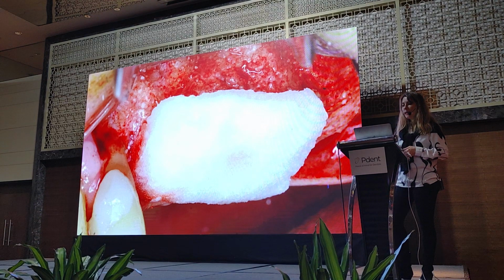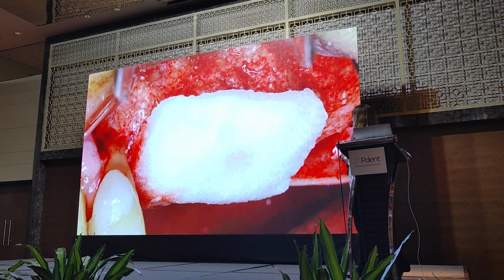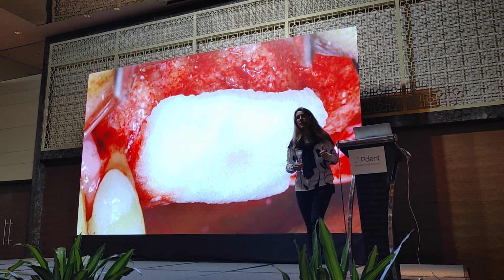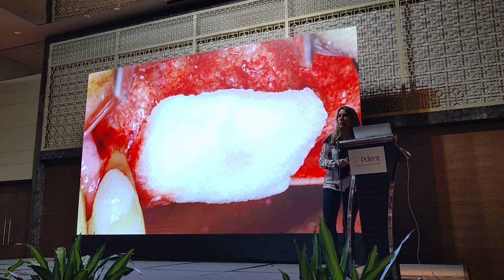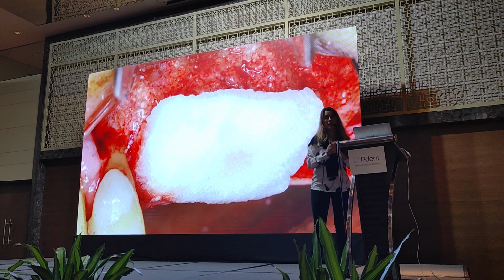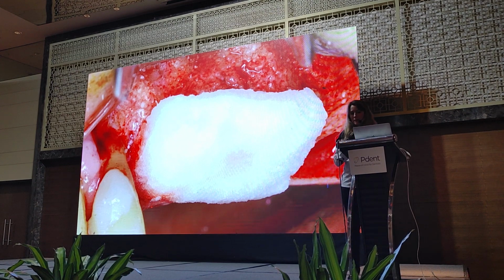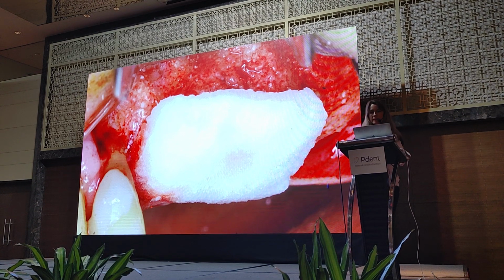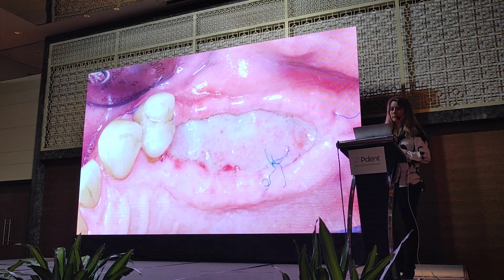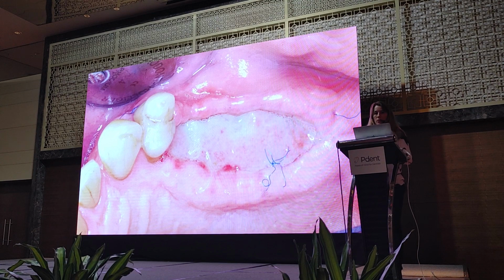I had a very bad idea of using a xenogeneic matrix. These matrices you can use on perfect patients, but never on a patient who already had an infection, not on a patient with diabetes, not on patients who already had problems with healing, because they work only if everything is perfect. So that's what we got: a second gingival necrosis.